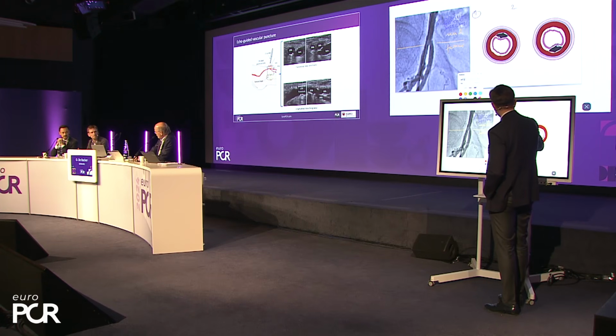I have a question for you. You told us you would like to avoid the 1 centimeter above the bifurcation. Can you explain why you do this? And what do you do when this is the only spot which is calcium-free? Would you still avoid it, or would you make an exception? No, I would still avoid it.